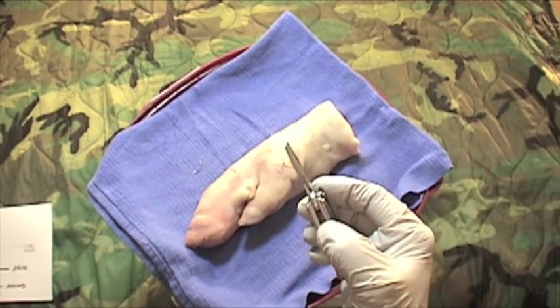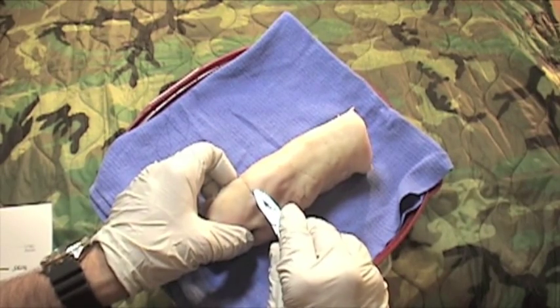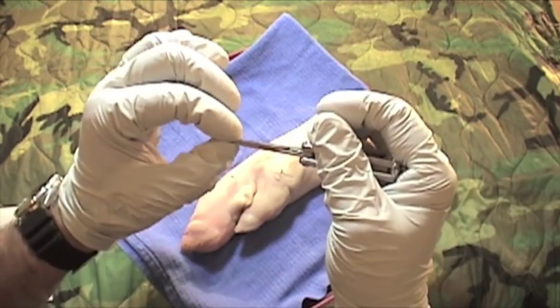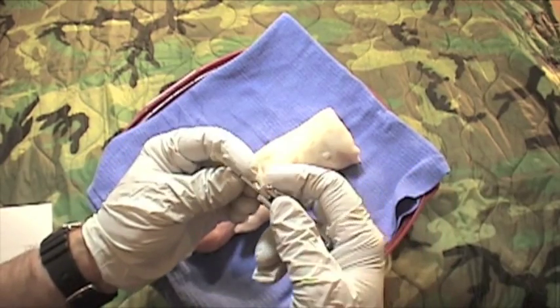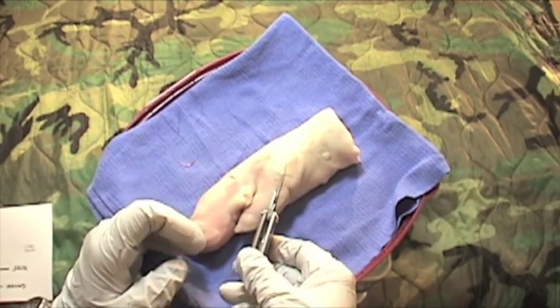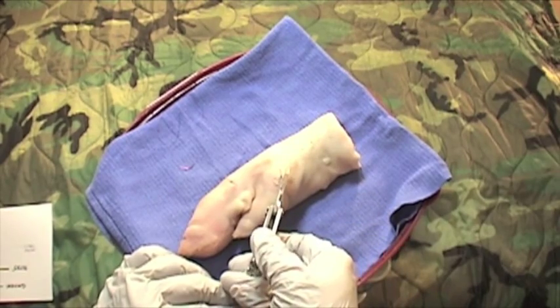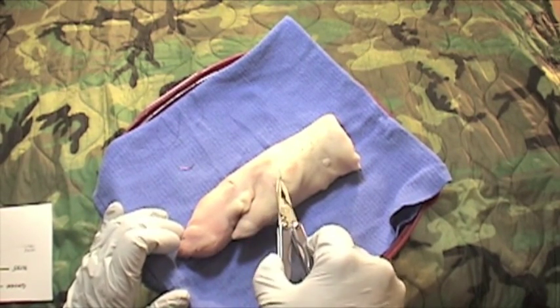This Squirt gives you some useful parameters. How close to the wound edge should you go with your needle? About the thickness of the tip of the blade is about the distance away from the edge of the wound to the entry point of the needle — just a good visual reminder. How far apart should you space the sutures? Look farther back on this Squirt and you'll notice the blade is thicker — that's about the right distance to space your stitches. Divide the wound in half and put your first suture in the middle, then space additional sutures about the thickness of the Squirt apart. This wound would be closed with three stitches.